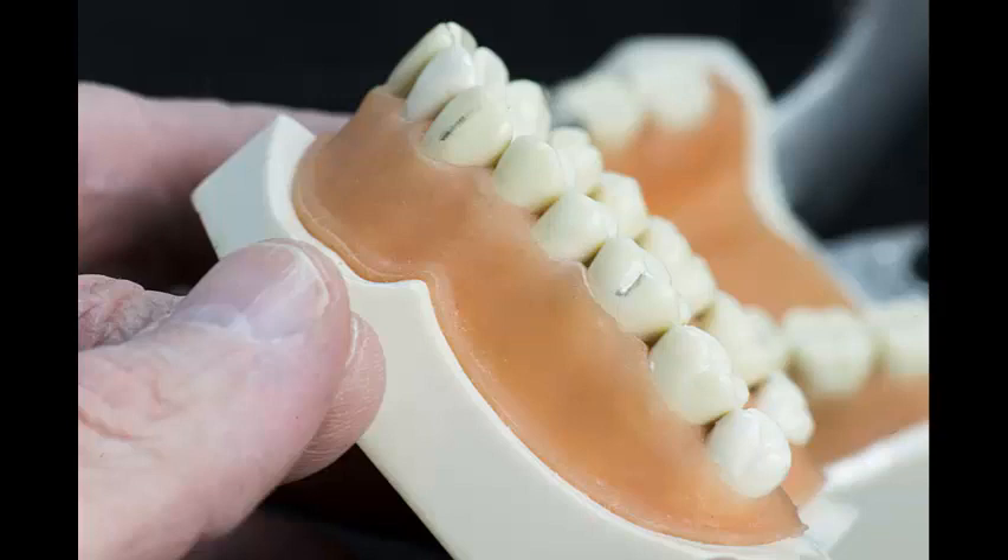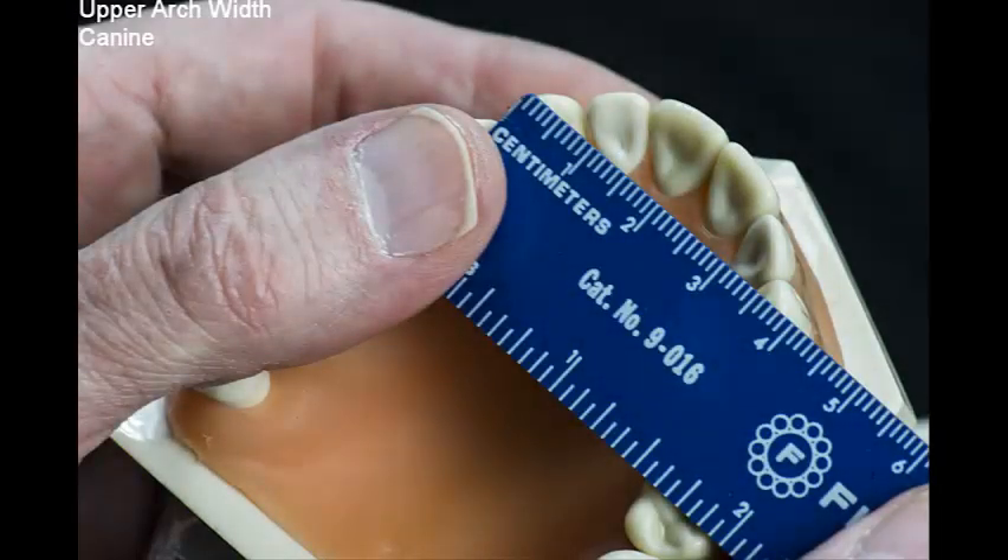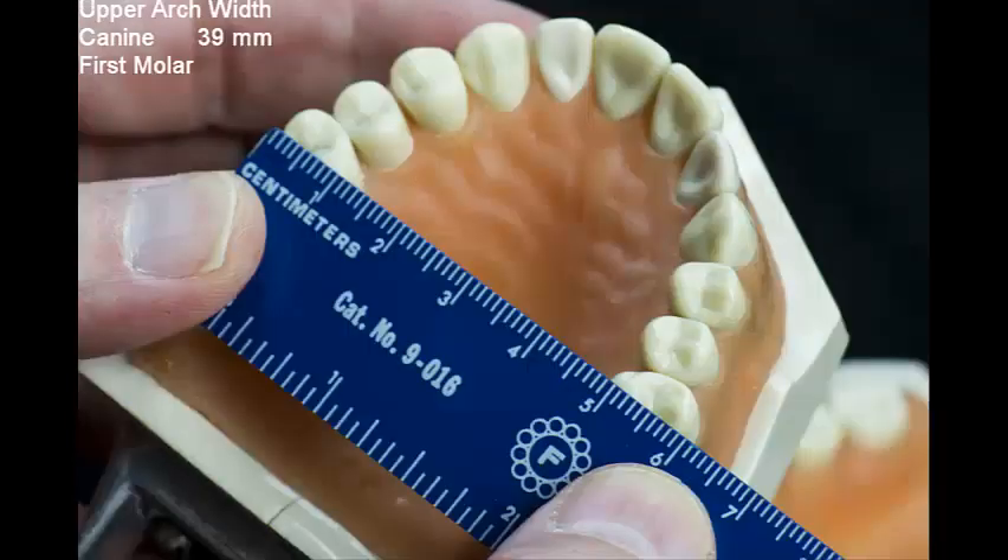Using these landmarks, I will measure the intercanine and inter-first molar widths. Here I use a millimeter ruler, but for more accuracy, one would use digital calipers. On the typodon, I measure the intercanine width to be 39 millimeters. Repeating this for the first molars, I measure a width of 58 millimeters.